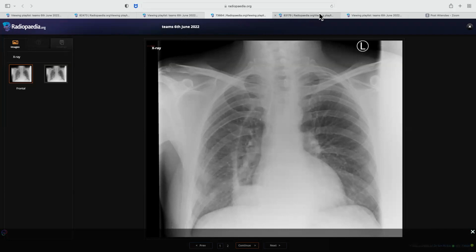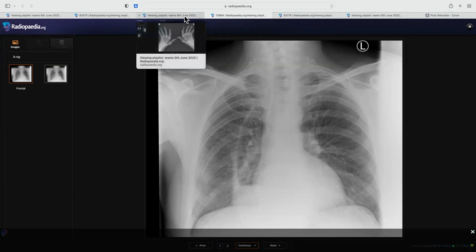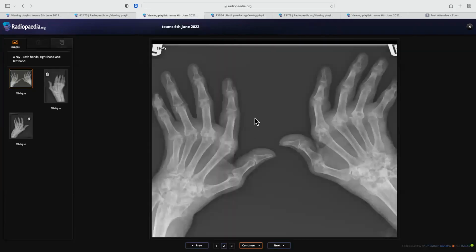You told some of the classical cases, like ruptured abdominal aortic aneurysm and cervical spine ankylosing spondylitis fracture, which was really very good. Now, these are cases which we do not commonly see, but if you see them now, you will not forget them. That's for sure.